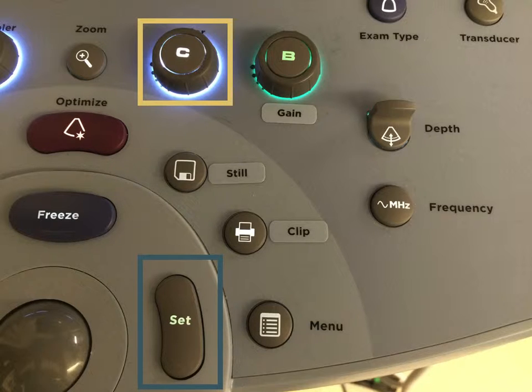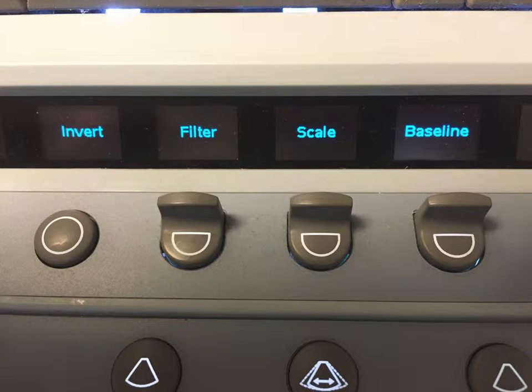I suggest making the color box just a bit bigger than your area of interest. If it's too big, it will take up too much computing power and you might notice that your images aren't as smooth. If you make it too small, you can miss identifying flow in your area of interest. When you have the color button selected, these 4 words will appear on the console. The only one we really need to concern ourselves with at this point is the scale button. We can toggle it up and down to change the velocities that the ultrasound machine will be picking up.